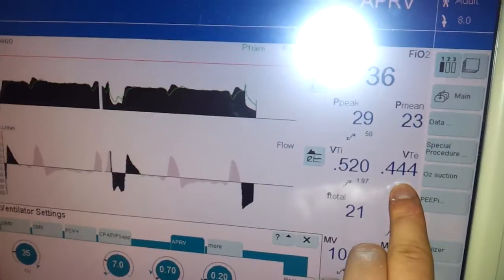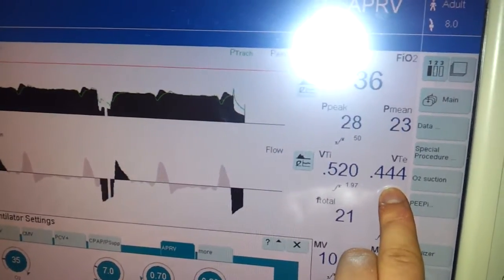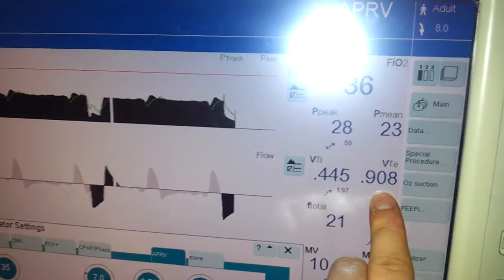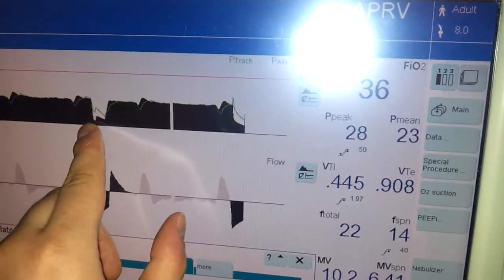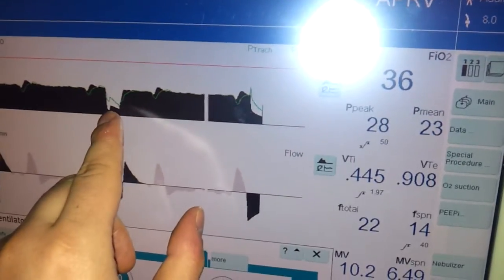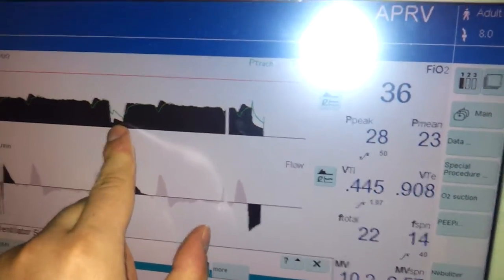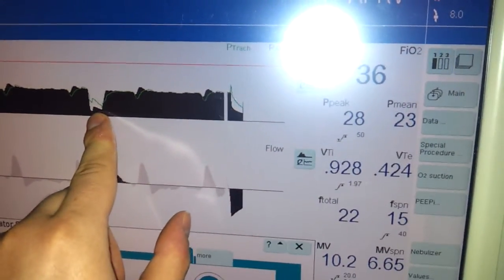If you look at the exhalation tidal volume, you can see small breath, small breath, and then a big breath once you hit P low. So that's where the big exhalation takes place.